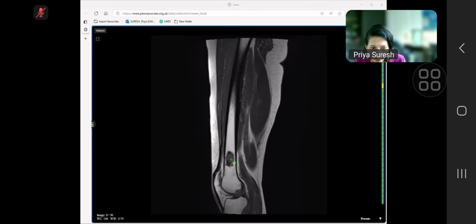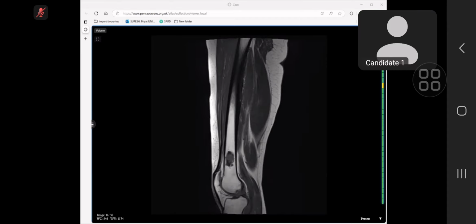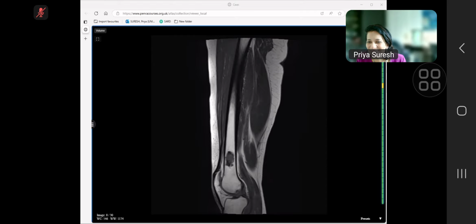It has a very narrow zone of transition, and speckled calcification within it. All those features are in an Enchondroma. But if the size is more than 4 centimeters, I think it is a 3-year follow-up with MR that you should do, and it's called BACTIP. It's from the Royal Orthopaedic Hospital, Birmingham, that they have set guidelines for when you will image a chondroid lesion, especially around the knee and proximal humerus. So that is your second homework, to look up the guidelines. But very well done on that.